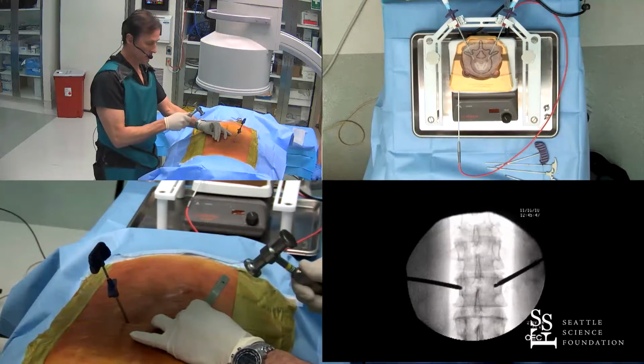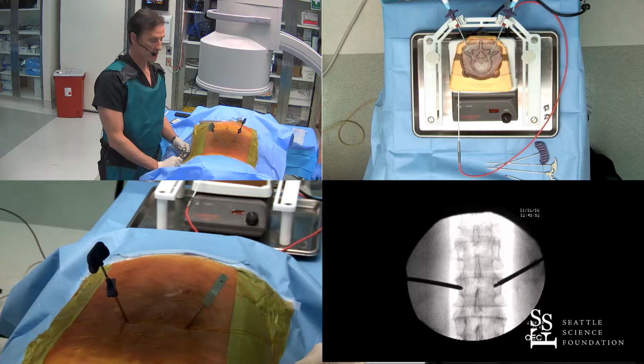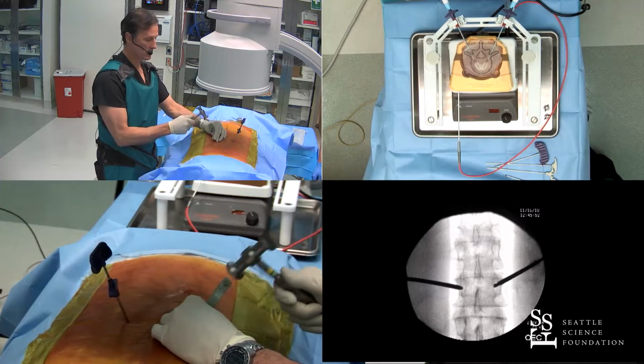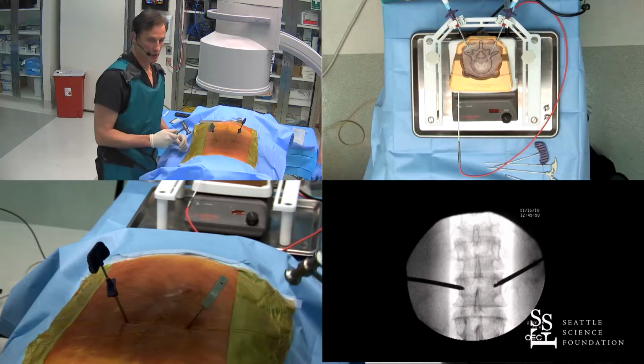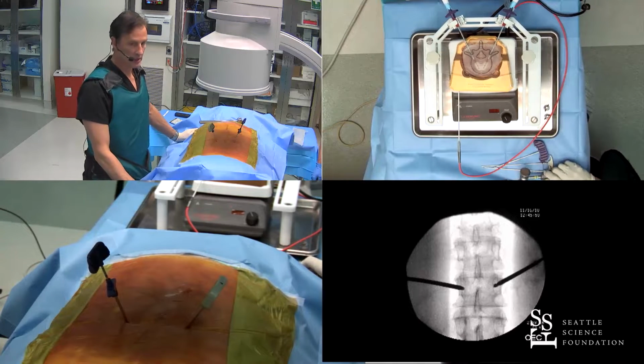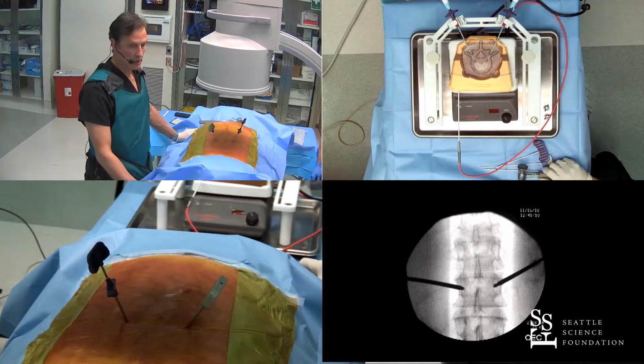And we're going to do the same thing here. I'm going to show you a little trick whenever we come up to the medial portion, medial border. Does everyone see that? The pedicle, and you're concerned about it. Let's say, hypothetically, we switch to the lateral portion, and we're not quite past the canal to the posterior border of the vertebral body.